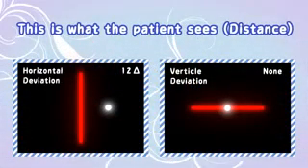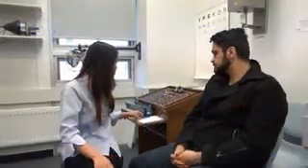deviation present. Okay, so based on your results, it looks like you have your right eye turned outwards, just slightly though, which is okay. It might be a bit worse in the distance, but only a bit.